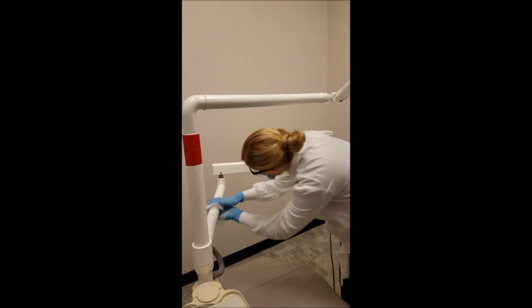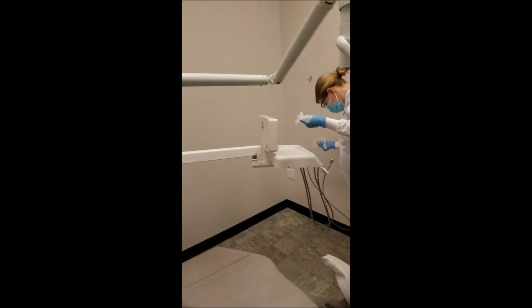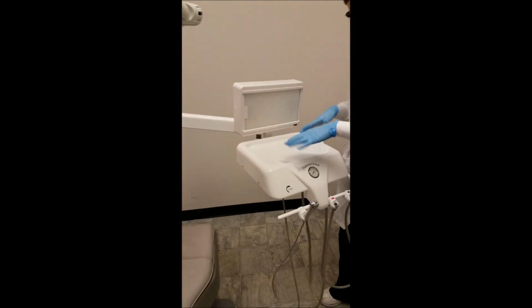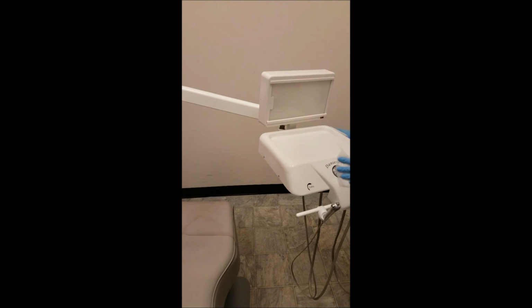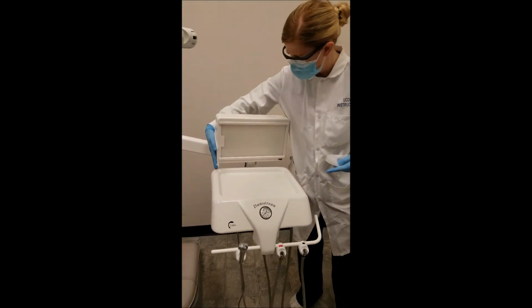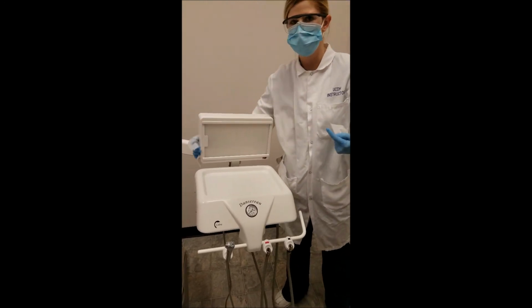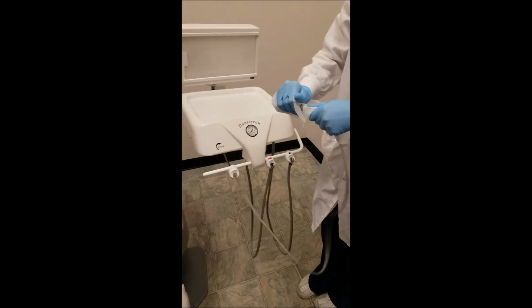Then she will move on to the bracket tray arm. And then the bracket tray. Then she will move on to the view box. Never touching the face of the view box. And then she will do the handpiece tubing holders and tubing.